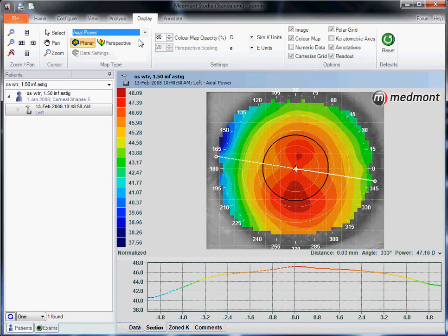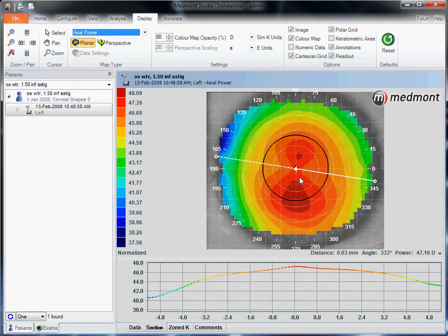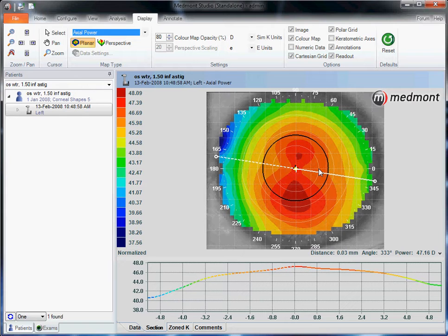Axial is one of the most commonly used interpretations of corneal shape. It tells us the powers distributed across the anterior surface and how that might contribute to the patient's acuity or refraction. In this case, we see within the pupil a figure-eight or hourglass shape, normal in an astigmatic eye that is fairly regular. This patient would be described as having regular, as opposed to irregular, corneal astigmatism.